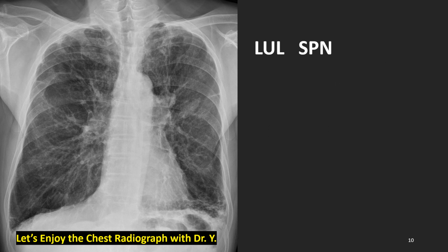Now we have basic information about small cell lung cancer, and with this knowledge, let's enjoy the chest radiographs. What do we see? Ovoid nodule here, maybe 2 cm ovoid, and emphysema in basal honeycomb lung. Honeycomb lung means interstitial lung disease provoked with strong prolonged smoking. UIP, usual interstitial pneumonia. Yes, there is a nodule here, solitary pulmonary nodule in the left upper lobe.